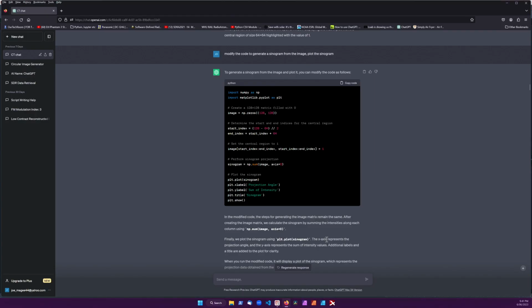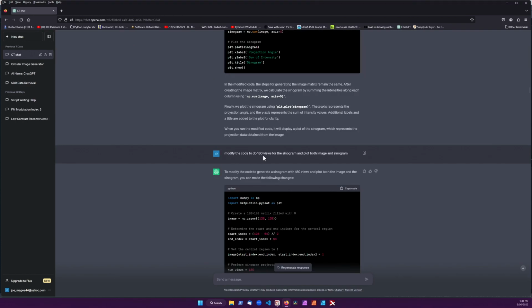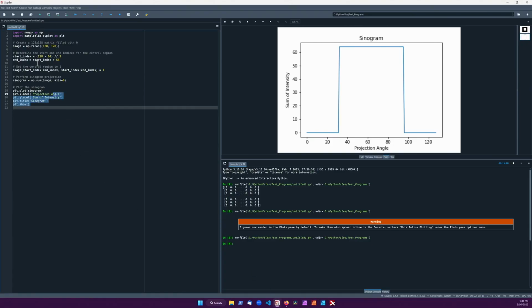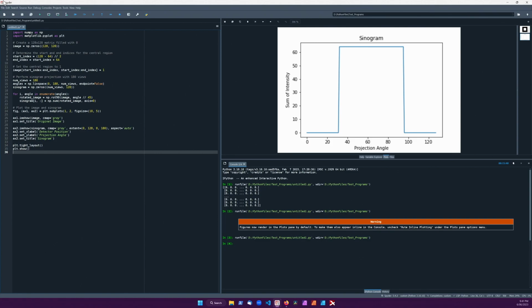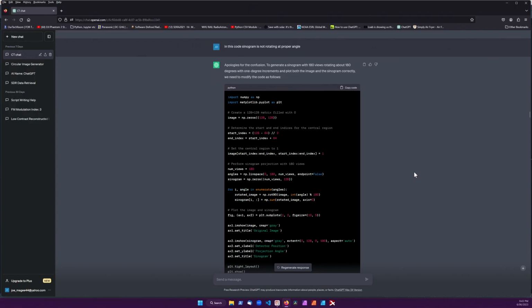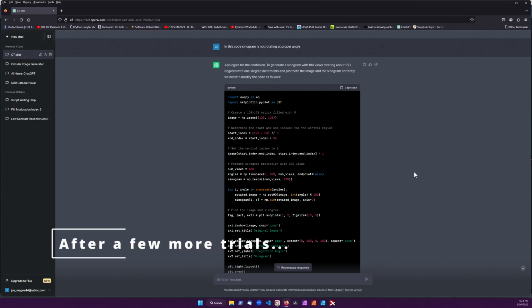So I went back in and asked it to modify the code to do 180 views for the sinogram and plot both image and sinogram. And it came back up with a slightly longer code. So I'll copy that, go back into here, wipe all that, put the new code in, and do that. We're not quite there yet. We got the original image and we got the sinogram, but the sinogram is still not correct. So back in. All I said was, in this code, the sinogram is not rotating at the proper angle.